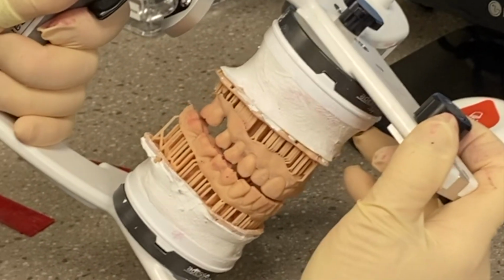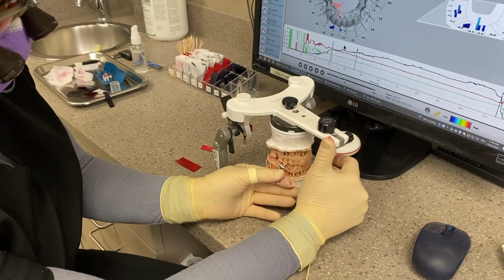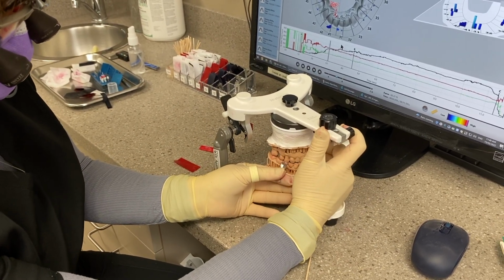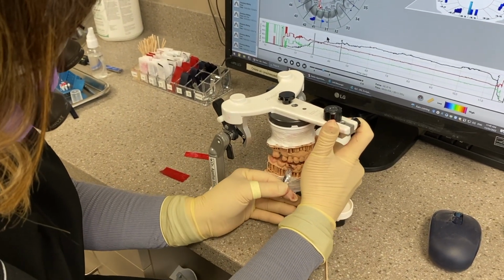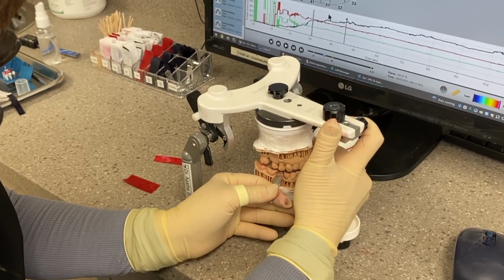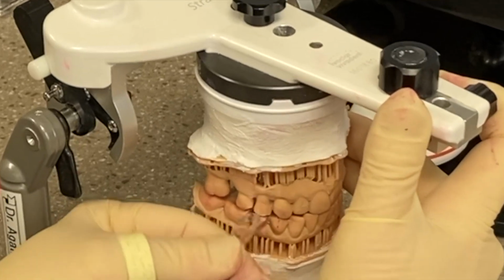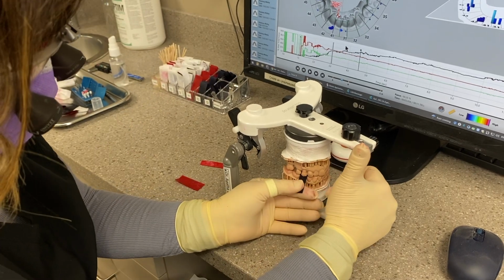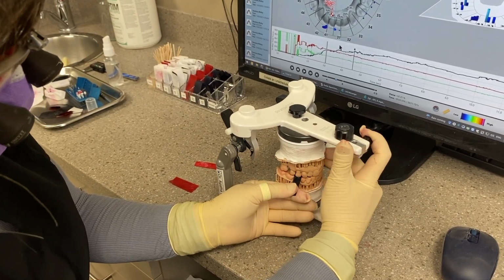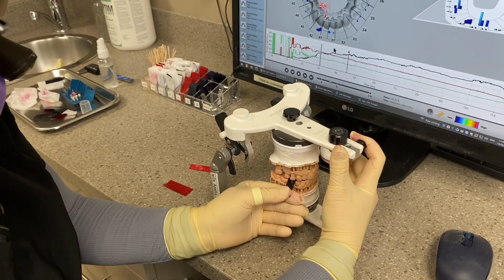So let's see. Did we clear? Yeah, she's fully on the canine. I always verify with shim stock. It felt like maybe there was a cusp hitting on the lingual, but I think I'm good. I can feel a tug. So that's a palatal cusp on a lateral slide, and that's significant. That can also cause a lot of symptoms. So always double check, because I could feel a tug here, see?